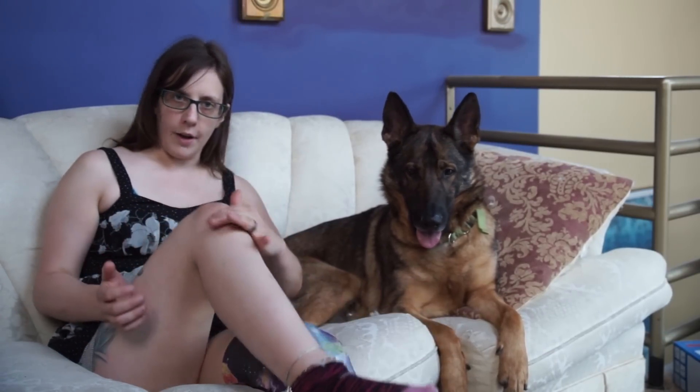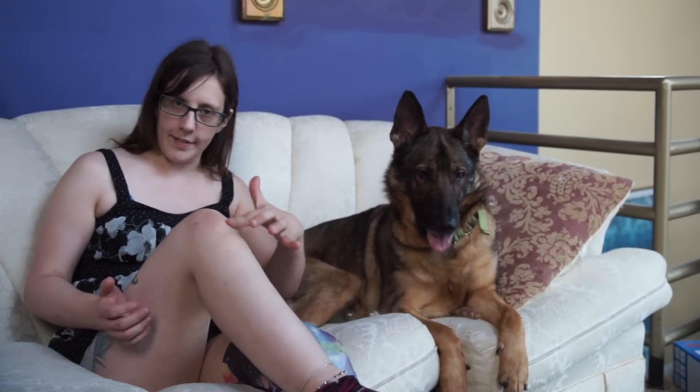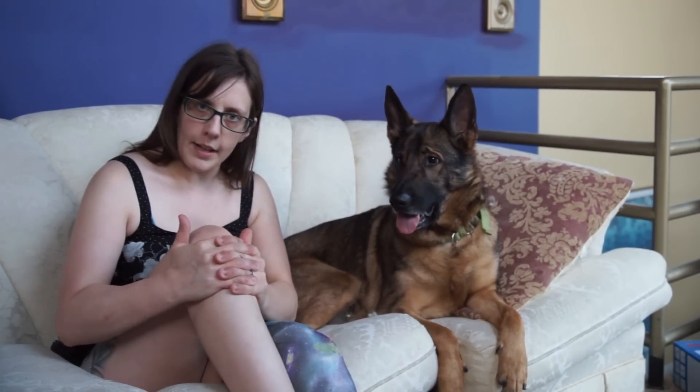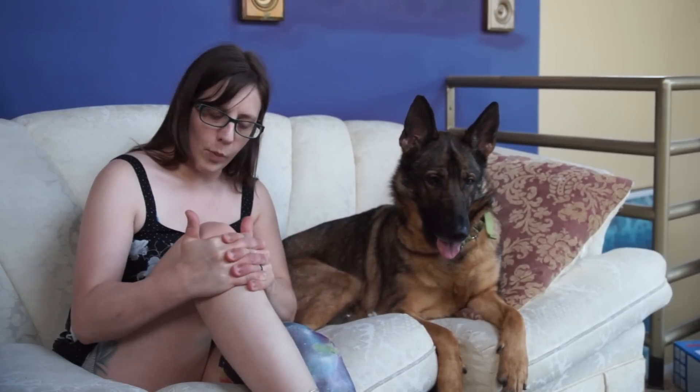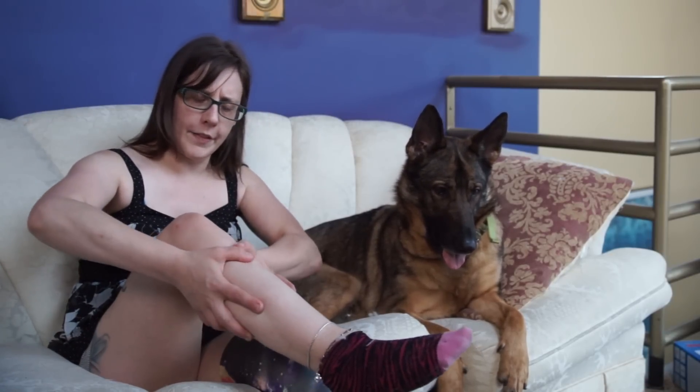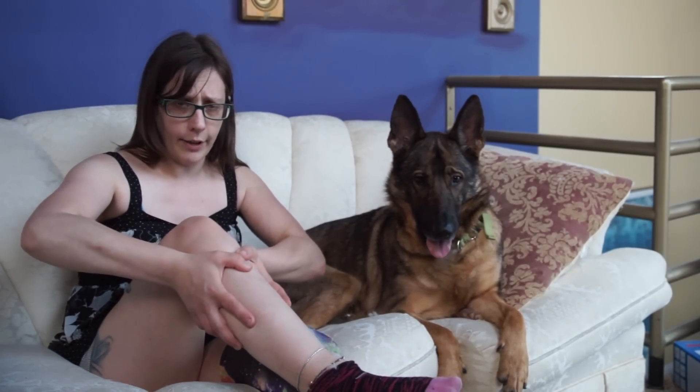Most of the weight bearing of a prosthetic occurs on your patella tendon, which is this tendon right here in your knee, and a lot of the weight you bear through the sides of your leg like this, so it kind of feels like when you walk you're wearing something really tight around your leg right about here. But it also feels sort of tight on the entire leg, kind of like this.